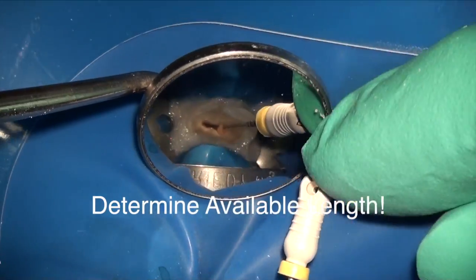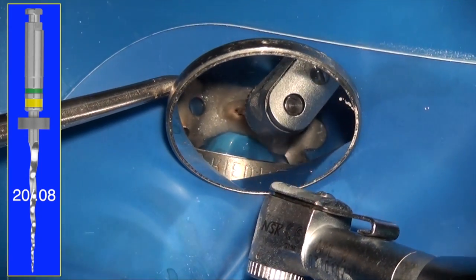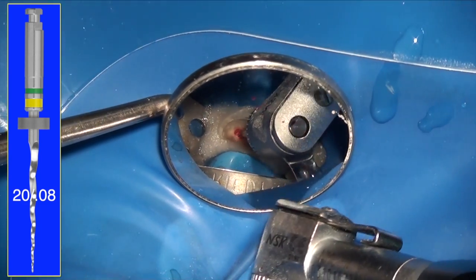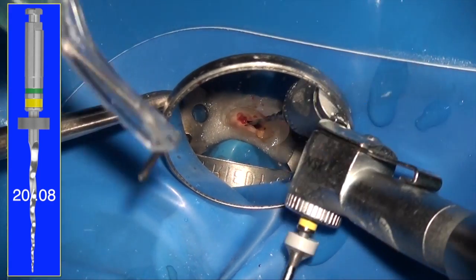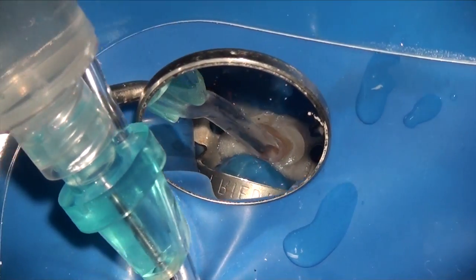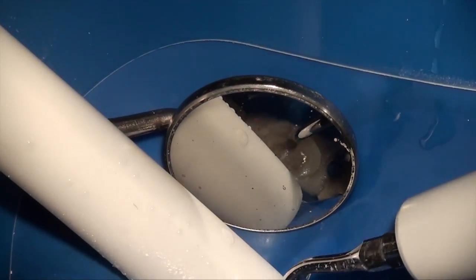Now I determine the available length, and what available length is: you put a number 15 hand file in there, and wherever it stops, that's your available length. And then you do an initial instrumentation using your orifice openers. Here I'm using a 20/08 ESX file, coronal to that length. You don't try to reach that length. That is a safe length that has already been determined with your 15/02 to be available. Now the ESX orifice opener is a size 20 tip with an 08 taper, and after a couple of SSC motions, and if you don't know what SSC is, it's a single stroking clean motion, you should look back at previous tutorials, we get some coronal opening.